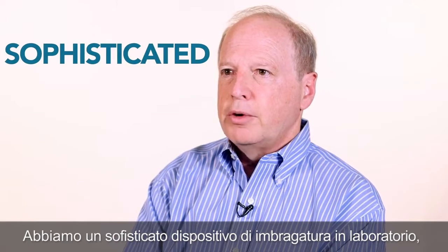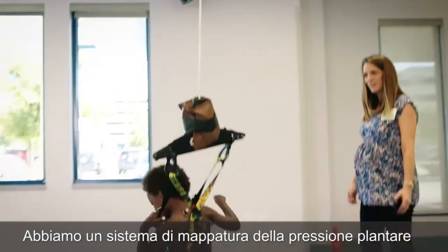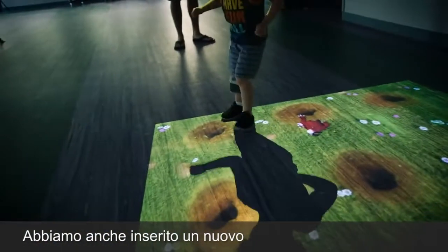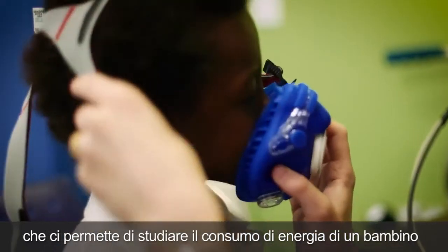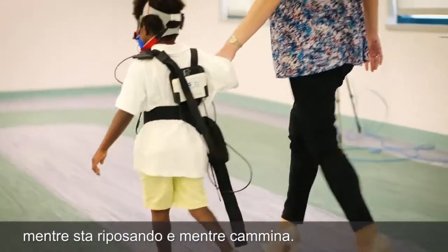By integrating a sophisticated harness device into the lab, then with our interventions, are we supporting less of their body weight over time? We have our plantar pressure mapping system that allows us to map the child's foot. We have also incorporated a new projected rehab system into our lab. And then finally we have the oxygen consumption system. What that allows us to do is to study a child's energy consumption while they're resting, as well as while they're walking. And so we've been very aggressive about adopting this technology and using it to treat children before they develop all the secondary complications like joints that won't move and bones that are bent in the wrong direction.